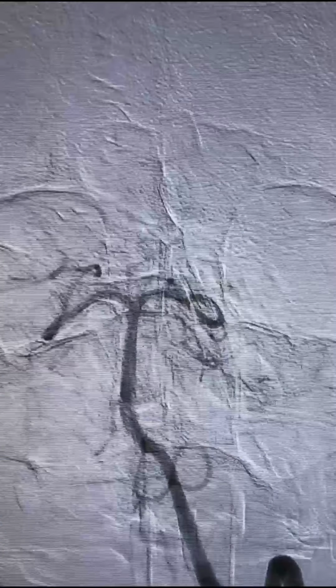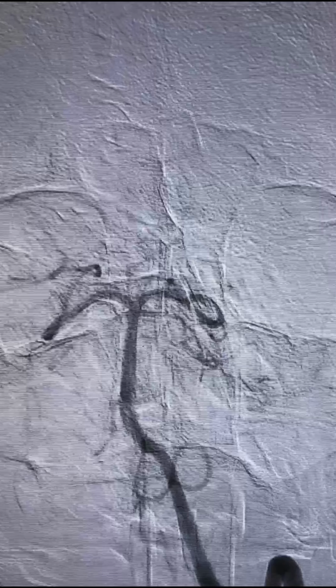So the image quality of this vertebral angio is poor because we have injected into the subclavian artery, not directly into the vertebral artery.